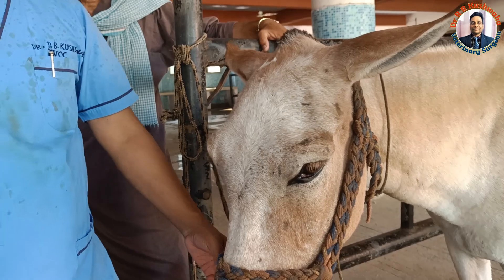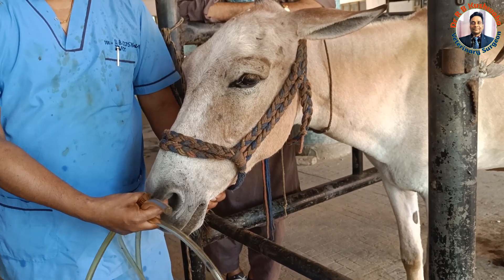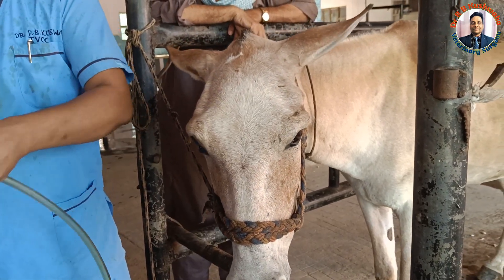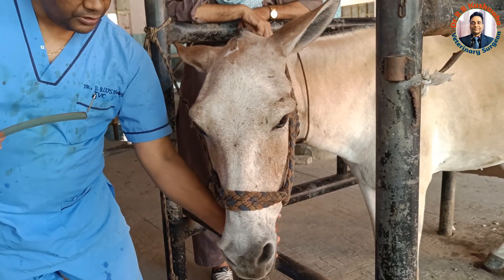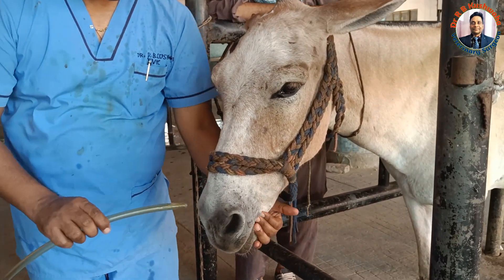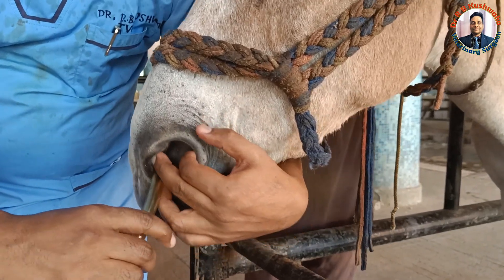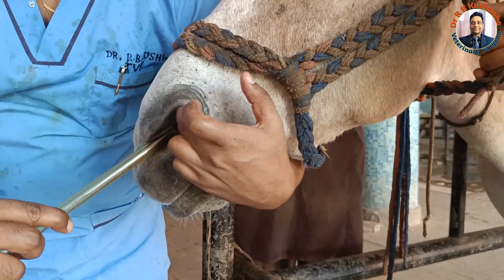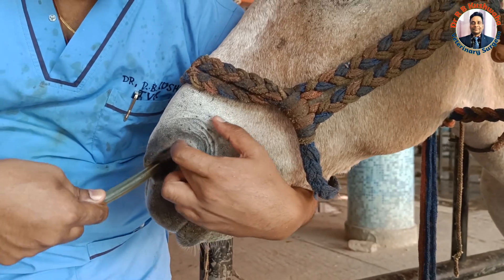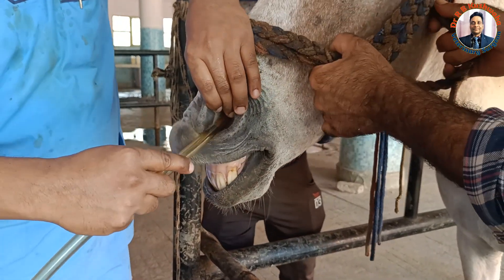For intubation, you stand either on the left side or the right side of the animal. From the right side, you can insert the tube into the left nostril, or even from the same side — this is up to the doctor. We should not raise the head. We simply keep the head in a normal position, then insert this tube. We should not insert into the false nostril; we insert into the true nostril.